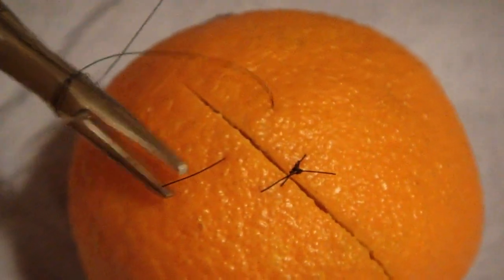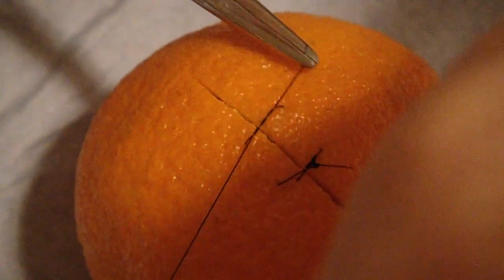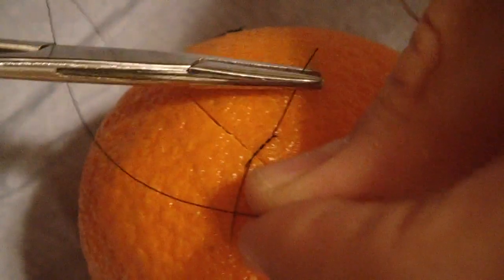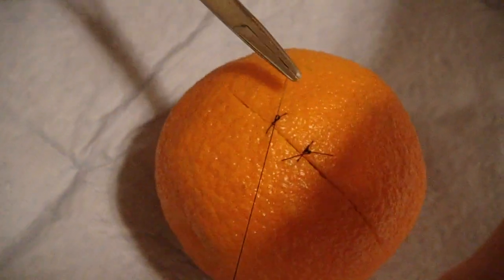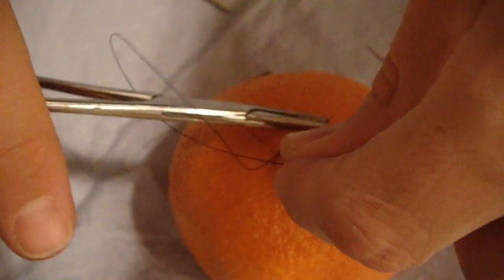Two loops. Full perpendicular. Single loop. Just for your information — the card you're able to trim.